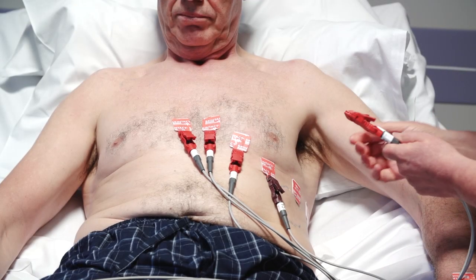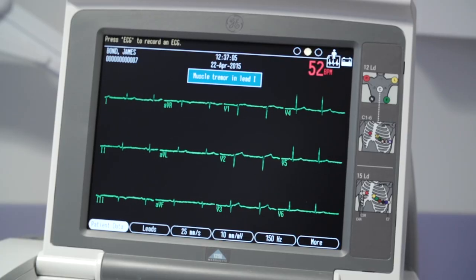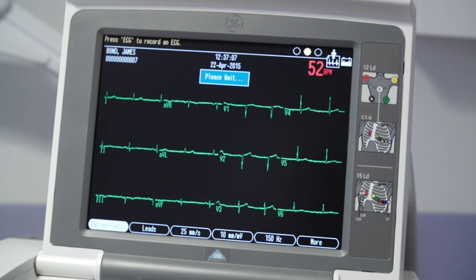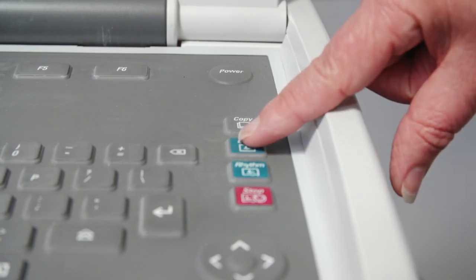Once the ECG leads are placed in the correct position, wait for the trace to settle so there is no muscle artefact or baseline sway. Then press the record button.